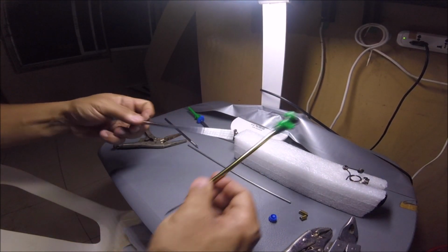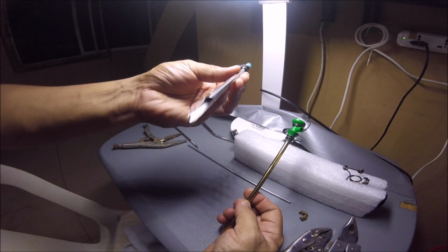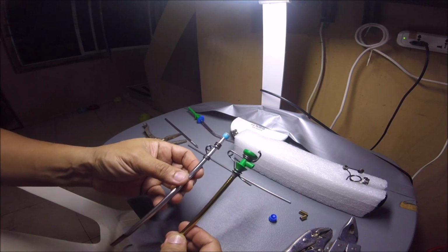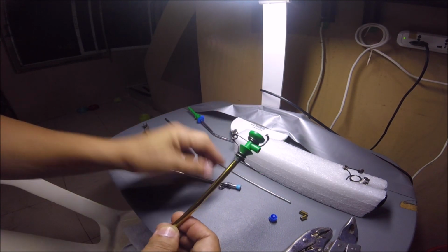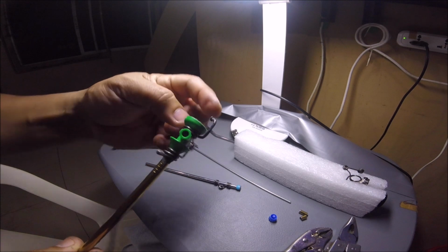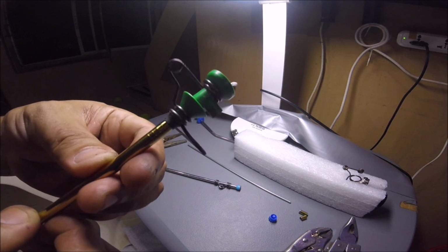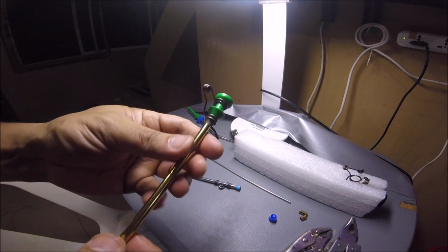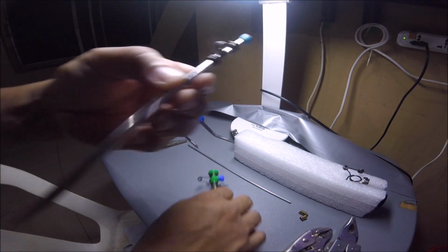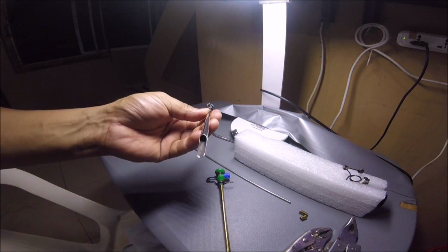Final run. So, original scope. The original scope sleeve. This is the new one, expanded, and of course I still have my spoke holder, water port. So this is the new one. You can actually see the ends of the spokes. This is the thread. That's triple butted, pillar spoke. So that will be my new tool for the next few cases. I'll still try using this simpler one, but this doesn't have a water port. That's the problem. We'll see.